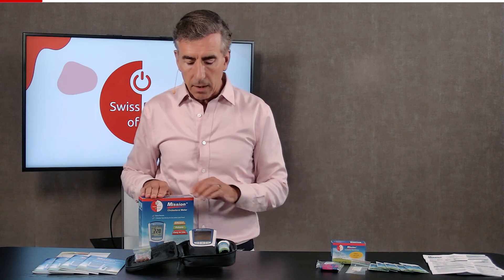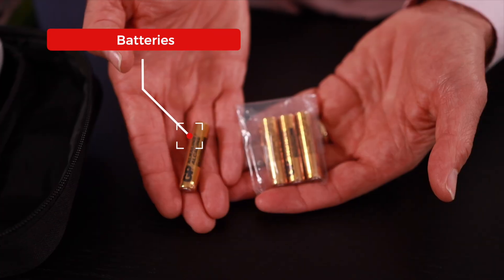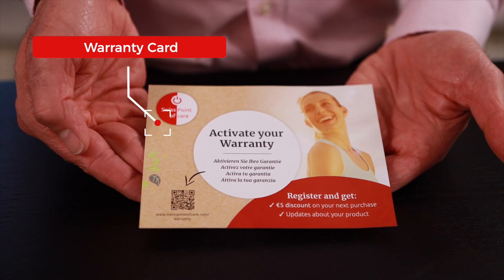In the box of the meter, you will find the meter, control strips, and batteries — so there's everything for the meter. There's the manual in different languages. There's the warranty card with which you can extend your warranty and get a €5 discount. And with that link you'll find all kinds of documentation that you might need for the meter.